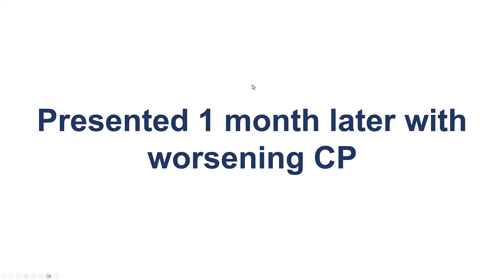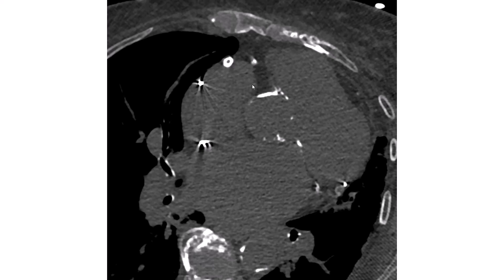After this second attempt, we were not planning to do another attempt, but the patient came back one month later with worsening chest discomfort and was told at another institution to go to hospice. Before deciding whether it was worth trying again, we obtained a non-contrast CT because of chronic kidney disease, just to confirm whether calcium was completely blocking the ostium of the right coronary artery. There appeared to be no calcification at the ostium — calcium was present everywhere else, but there was a short segment without calcium corresponding to the ostium of the right coronary.